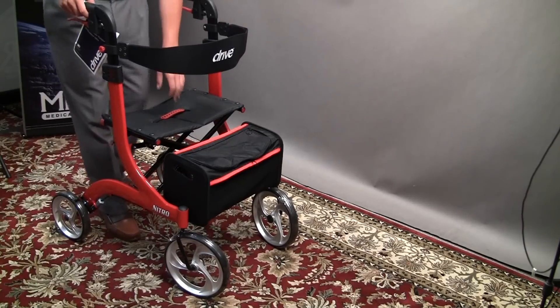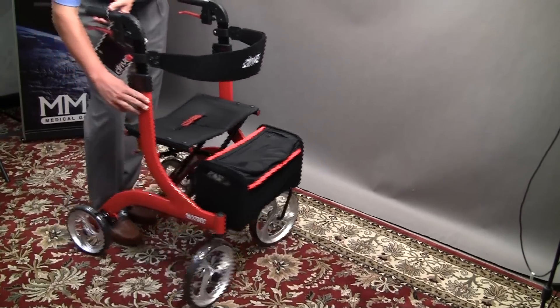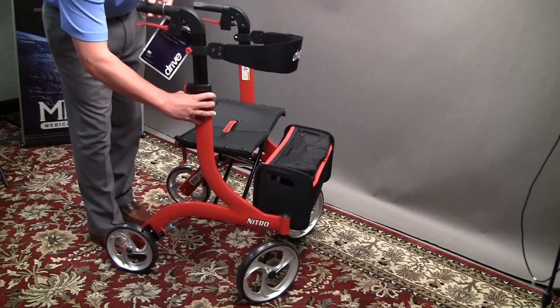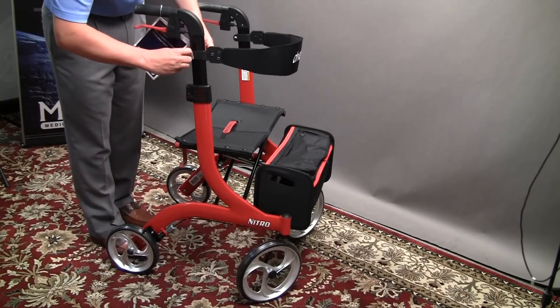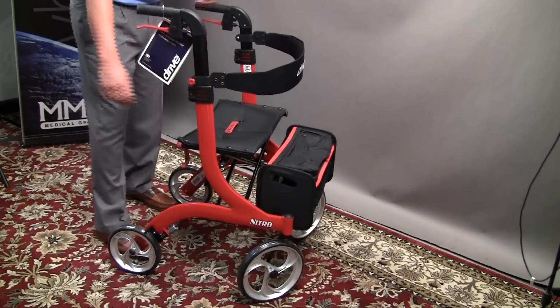It's got a lot of adjustability in terms of the height of the handles and the backrest. To adjust the handles, there's a button right there — you can go from low to high — and then you can adjust the backrest with this little knob here. It does it on both sides as well.